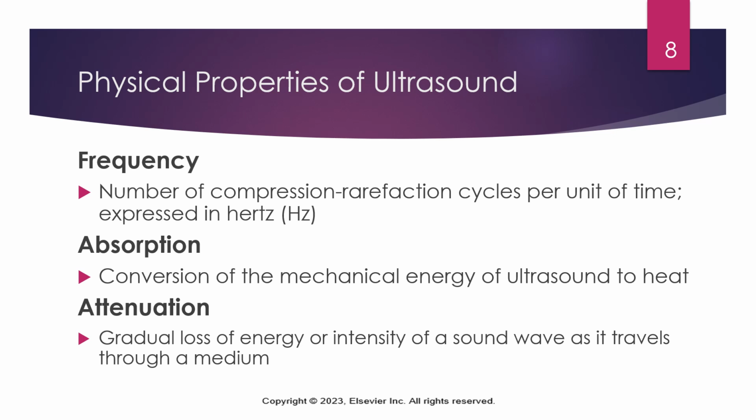And again, tissues with high collagen content like ligaments and tendons absorb that ultrasound energy better, which is why they heat up faster than something like muscle or possibly fat. Now we are going to talk about something that you need to look for as an adverse reaction. Burning, heating, significant heating of those tissues would be something that we want to be cautious of, which is why we're always going to keep that sound head moving over those certain areas. We're not ever going to allow it just to sit over an area because they're going to absorb that energy really fast.